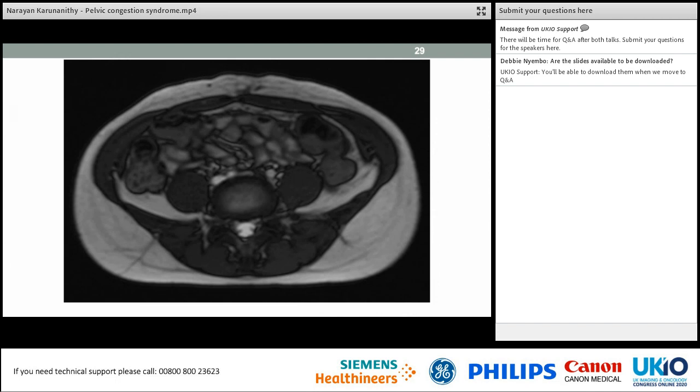And changing focus, again, as I mentioned, the MRI scans are used to look for other pathologies and for venous outflow obstruction. And this may be something that you see quite commonly and in the right clinical context would raise suspicion of possible venous outflow obstruction. What we're seeing here is a balanced steady state free precession MR venogram with no contrast. That is a standard protocol we use to image veins.